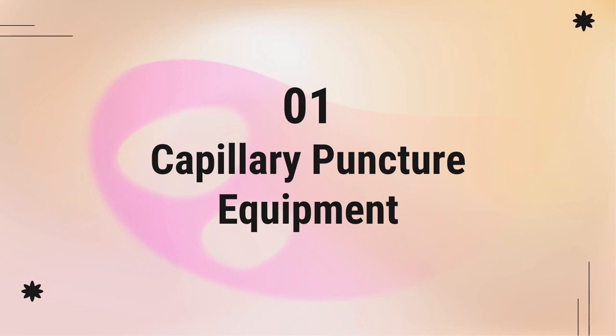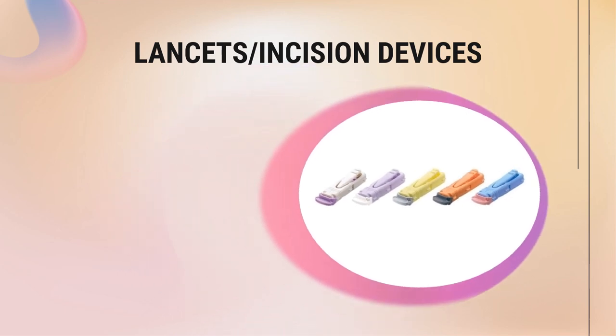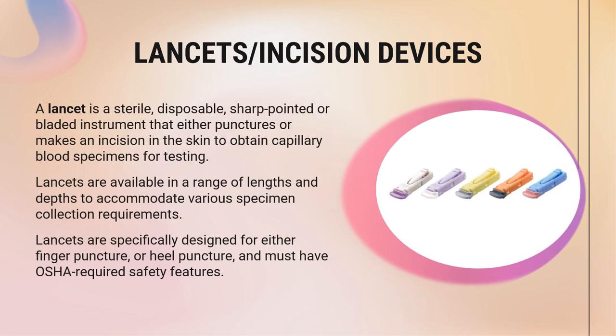First, we have the capillary puncture equipment. We have the lancets or the incision devices. A lancet is a sterile, disposable, sharp, pointed, or bladed instrument that either punctures or makes an incision in the skin to obtain capillary blood specimens for testing. They are available in a range of lengths and depths to accommodate various specimen collection requirements.